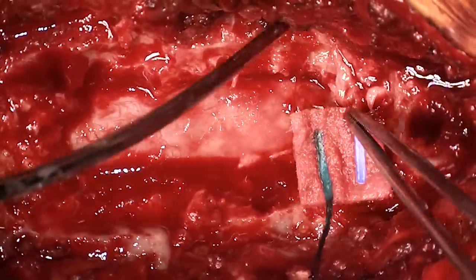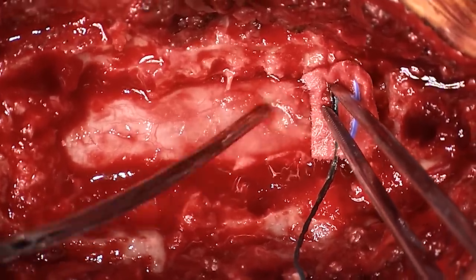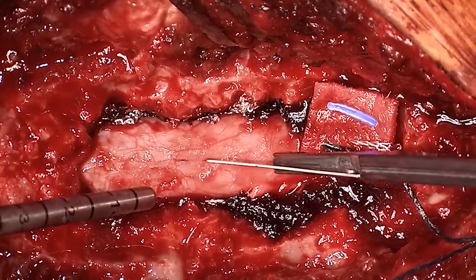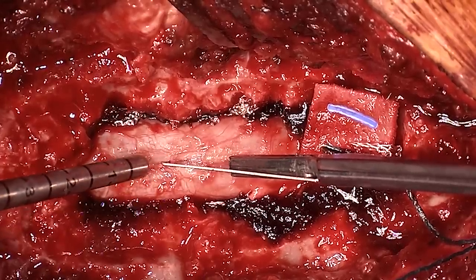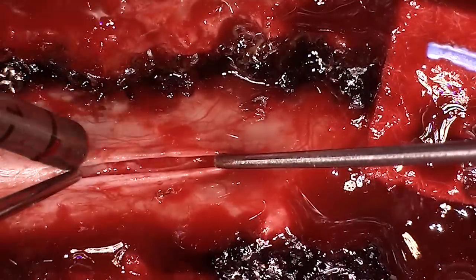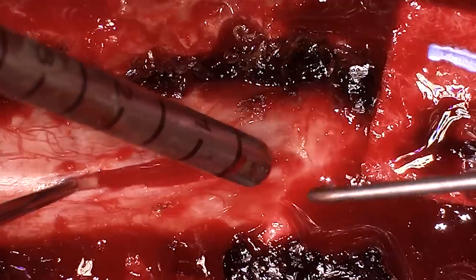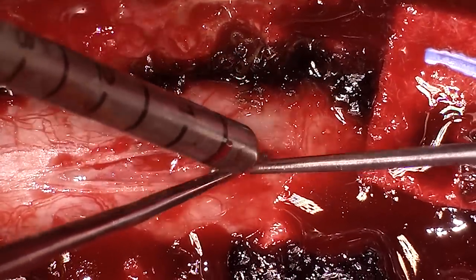We've got quite a large area of bone that we've taken off. The spinal cord will be under this dura and now we need to prepare to cut it open. So we take a scalpel and we make a cut in the middle. There are two layers to the dura so we just need to make sure that we go through each one of them without going into the spinal cord underneath. At this point once we've made a small hole we can use what we call blunt hooks to just gently tease open the dura from end to end and underneath that we have the spinal cord.